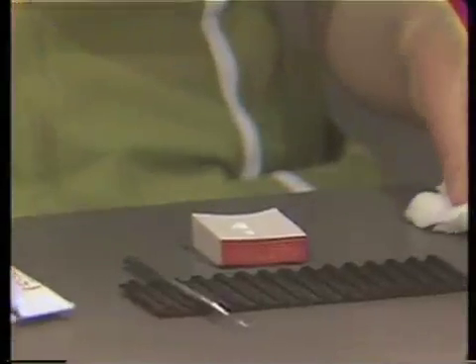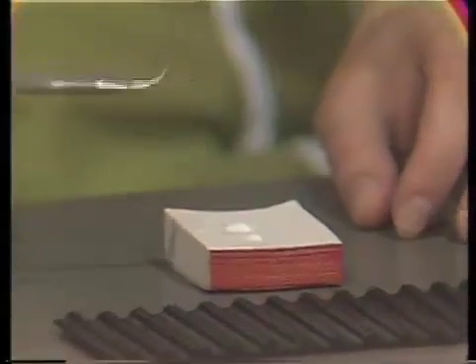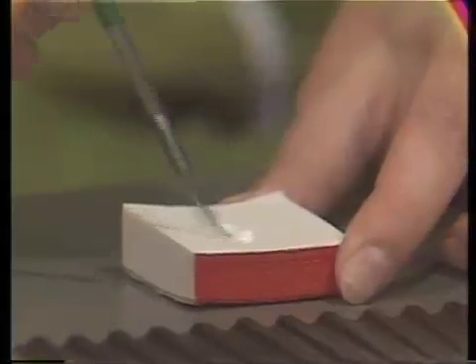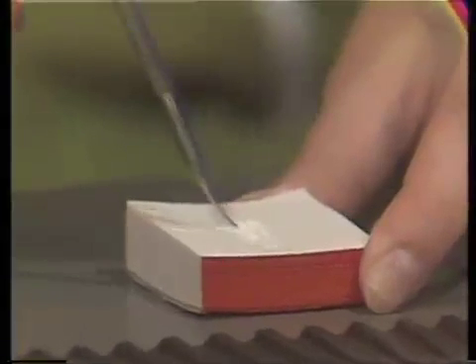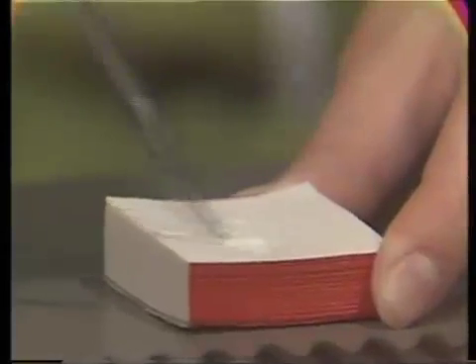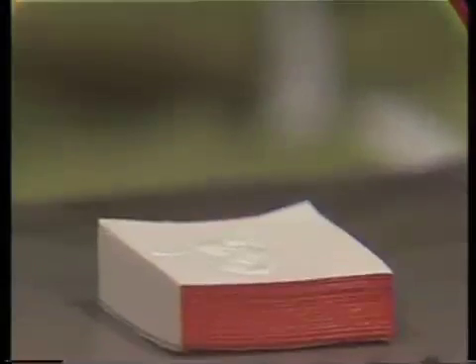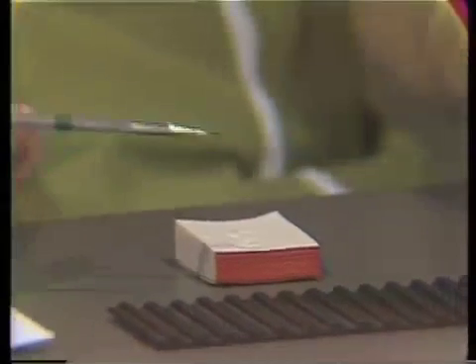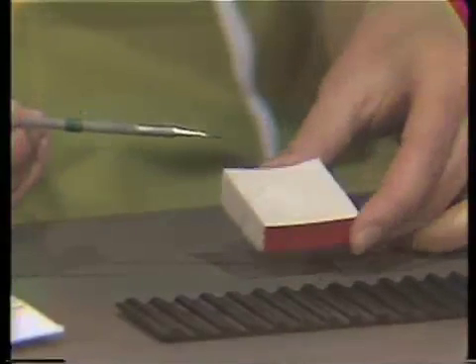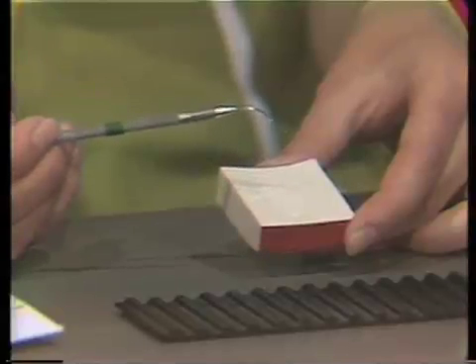The Dical is now ready to be mixed. Using a caulk applicator, mix the materials as quickly as possible during a ten second interval, blending them to an even consistency. After wiping the applicator tip with a clean gauze square, the Dical is ready to hand to the operator, who will in turn apply it to the cavity preparation.